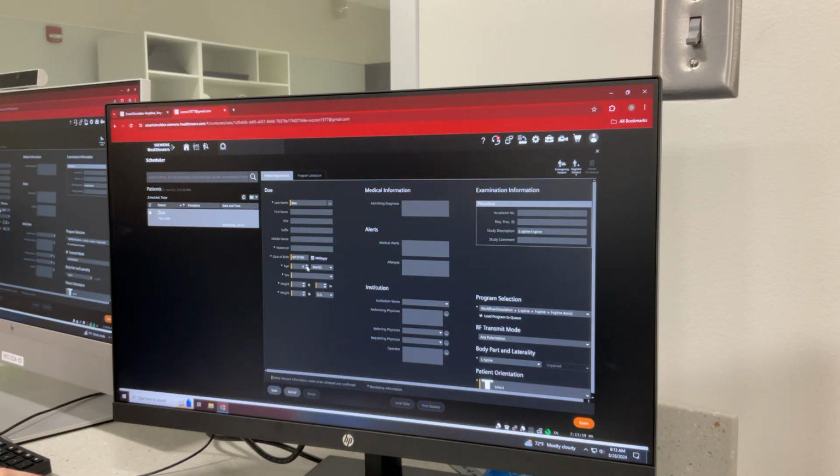You're missing that number. Five two. 80 pounds. Feel that right, because we're learning his weight. Okay, everybody get that? All right, so now you're going to go up and hit that program selection.